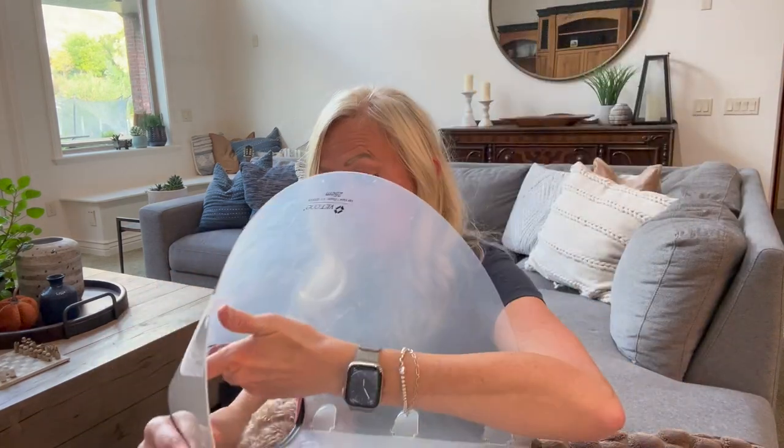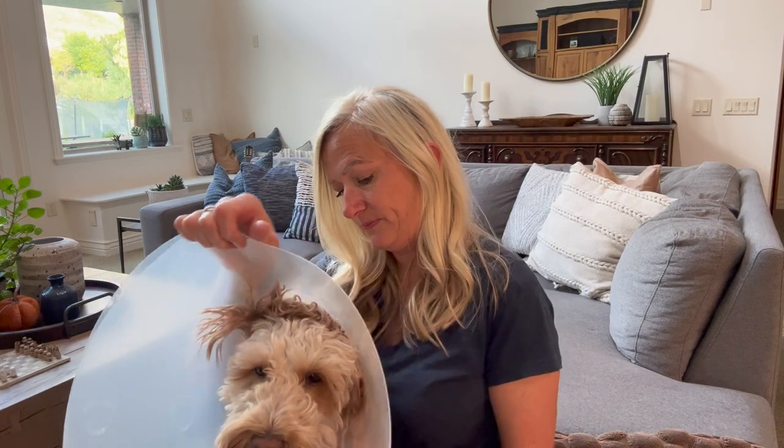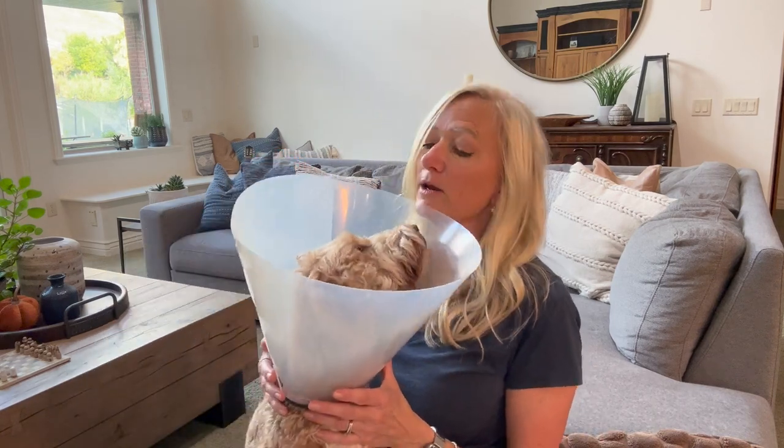When they get spayed, they end up coming home with the cone of shame. When Coco came home from the vet she was just wearing a simple collar, and we had some trouble keeping the cone on during the car ride home because there's only one loop in the collar and there are two strings to attach it to. So when you put the cone on and go to fix the ears, you have these two long straps and only one little loop to put them in, so it kind of wobbles around a lot — especially since this cone is so big for Coco.